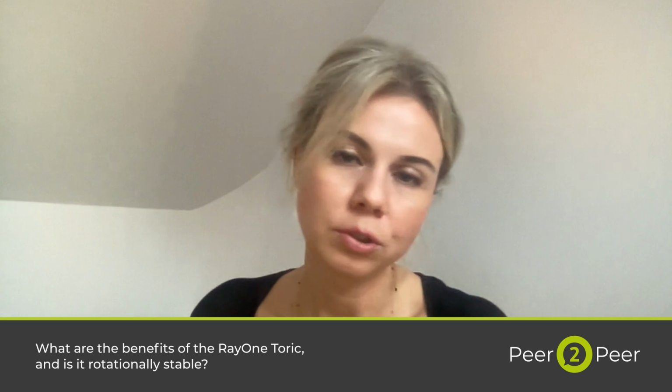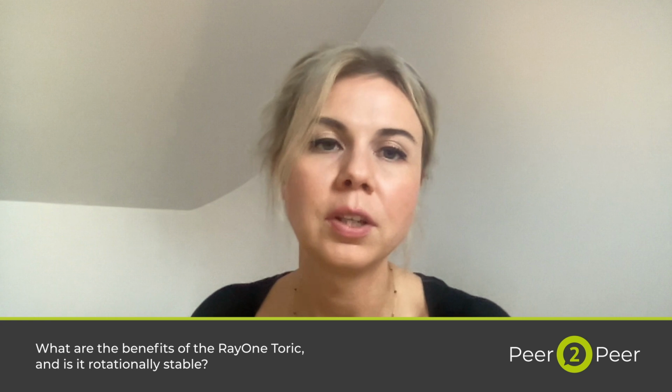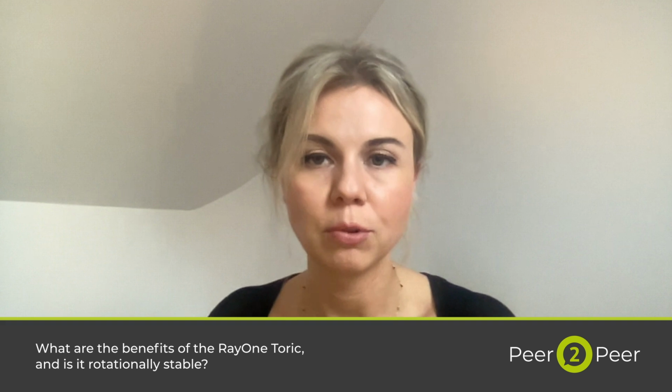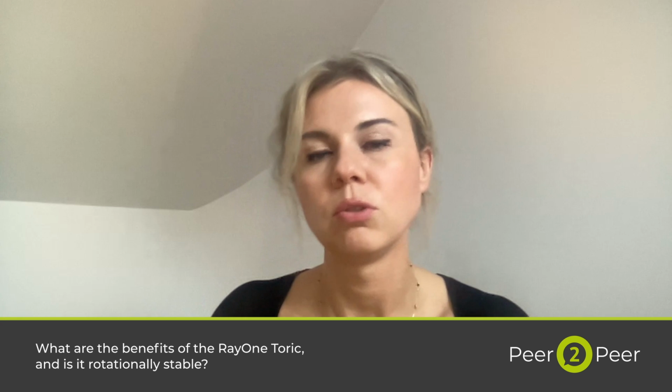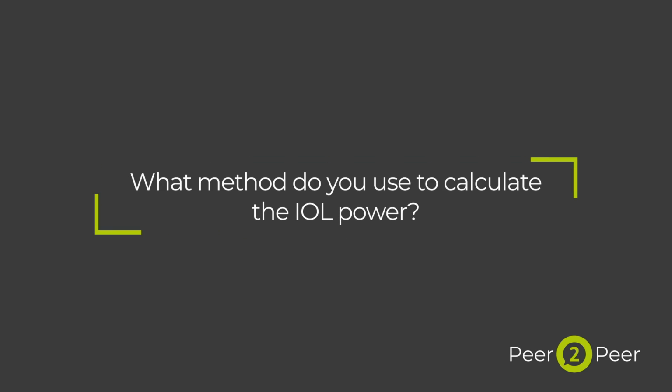Of course, adding the toric EMV to the portfolio of EMV is very important. However, I found that EMV is a little bit more tolerant to residual astigmatism, probably because of the spherical aberration. I implanted toric EMV and the results are very predictable and stability is really good. I use the Ray Trace online calculator. I find it very comfortable, easy and intuitive to use. It does include PCA, posterior corneal astigmatism, for more accurate toric IOL calculations.